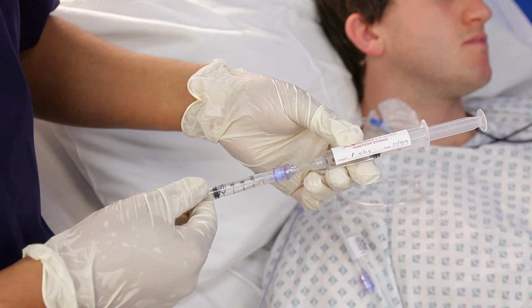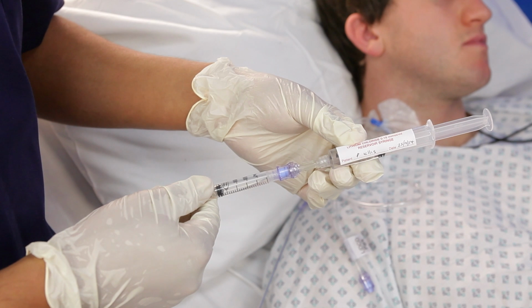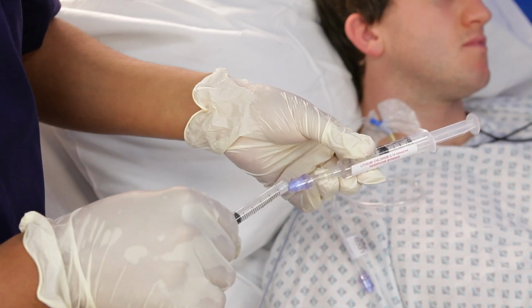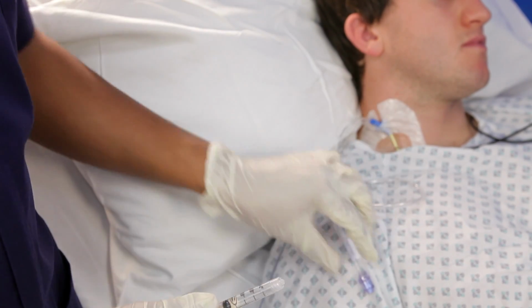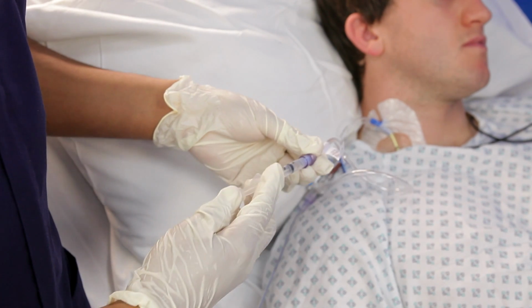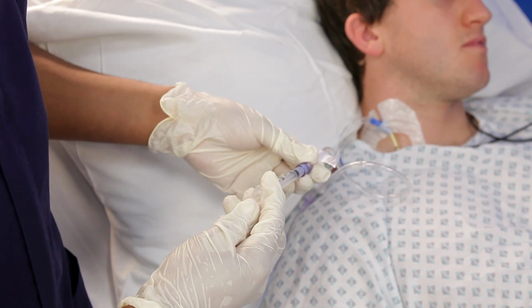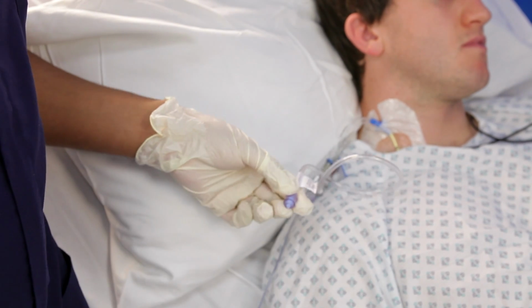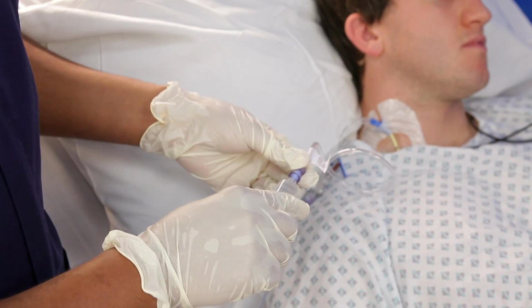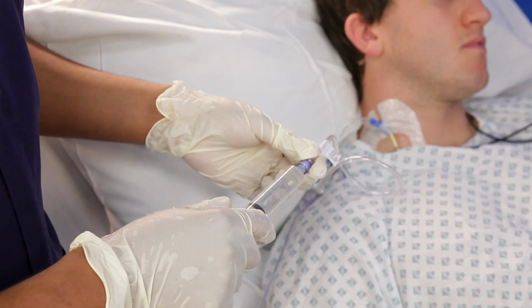Draw up a dose of lithium chloride using the 2 ml syringe. Before injection, ensure the CVC does not contain a pharmacological or therapeutic infusion. Now, inject the lithium chloride into the park and ride tube. Make sure this is accurately drawn up so that you have consistent results. Now you're ready to attach a 20 ml syringe filled with saline to the park and ride, ready to administer the lithium chloride dose.